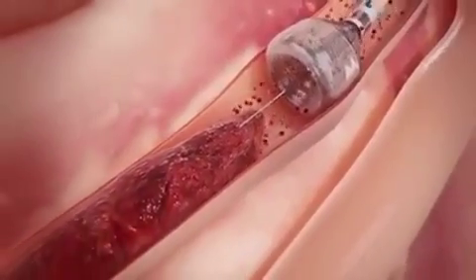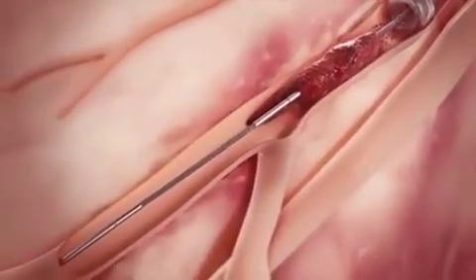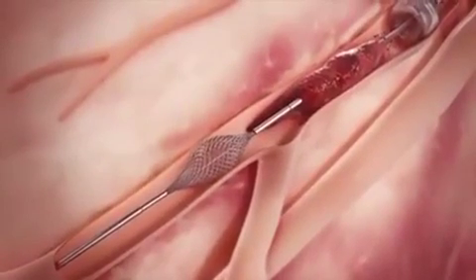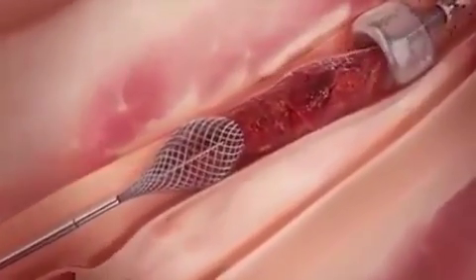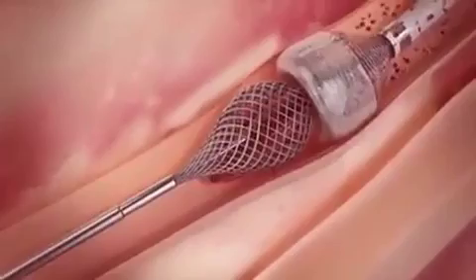Once the MEGAVAC arrests blood flow, the thrombo wire is inserted through the catheter, advanced through the clot, and deployed distal to the clot. While applying suction with the MEGAVAC, the thrombo wire is retracted to simultaneously pull the clot into the funnel mouth and through the catheter.